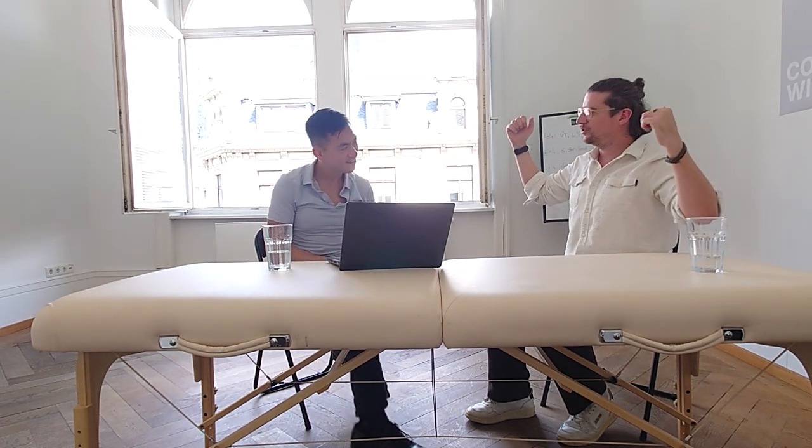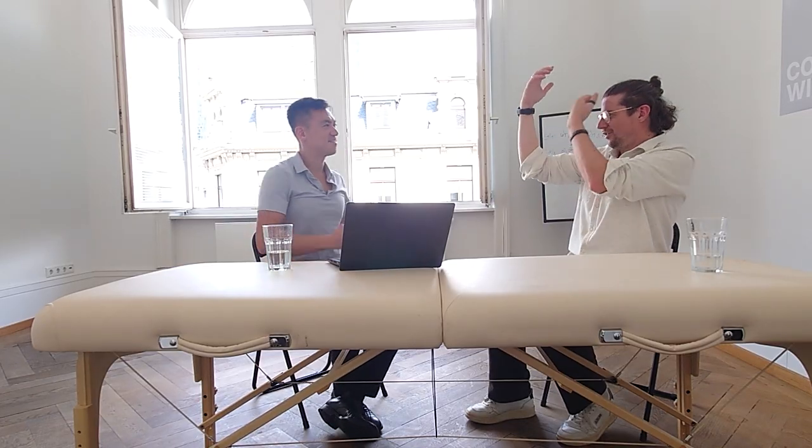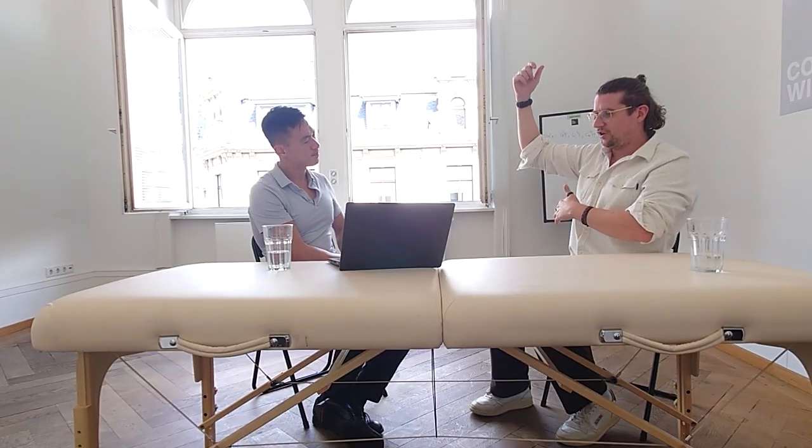They put sensors on the biceps and the lat, and especially for the male athletes, they used more biceps than lat, because it's more connected to the biceps but not to the lat. So you have the lat pull down machine, which is specifically made for the latissimus, but the majority of the men still use the biceps and do it as biceps training. So you need to be sure this machine should address at first the lat.